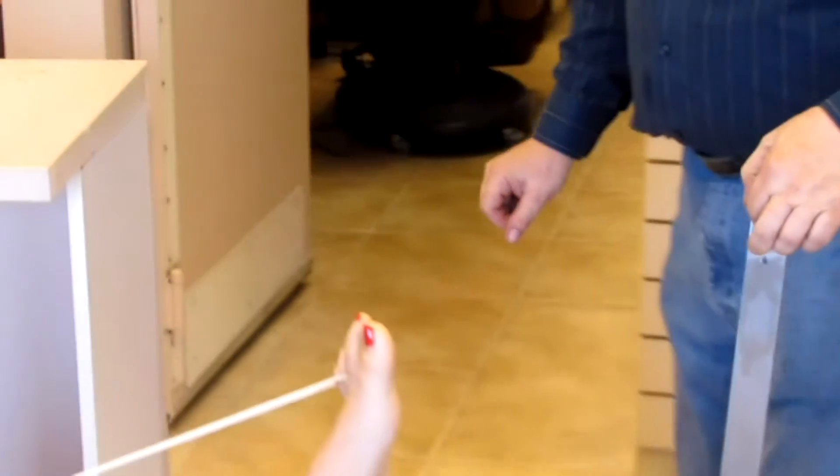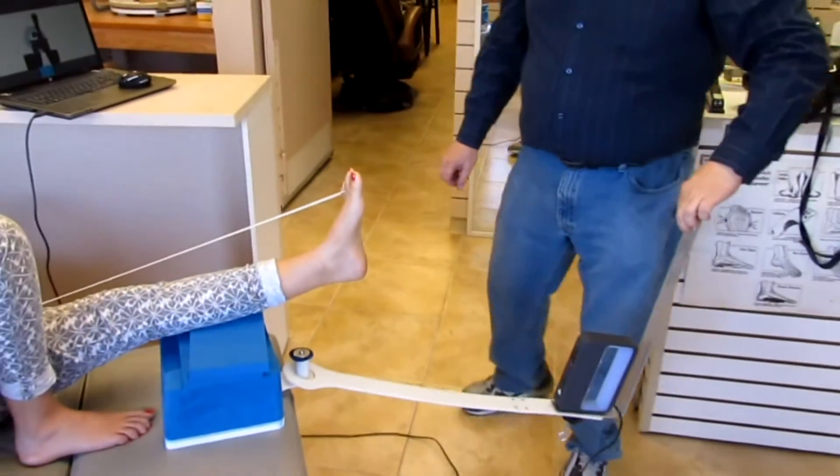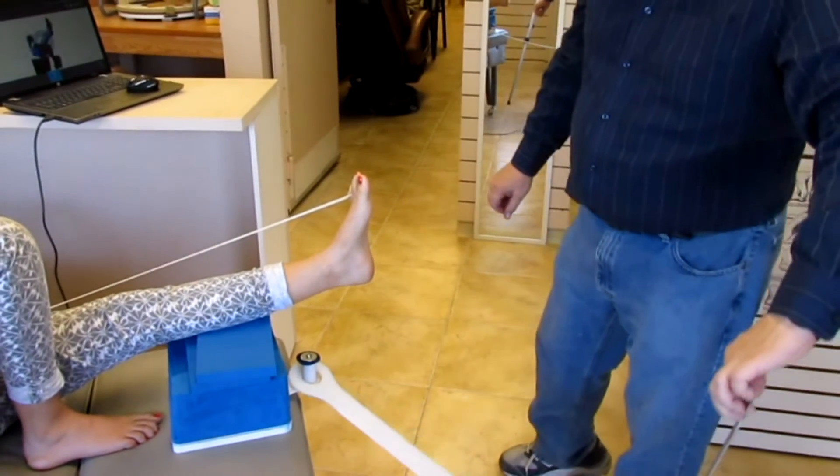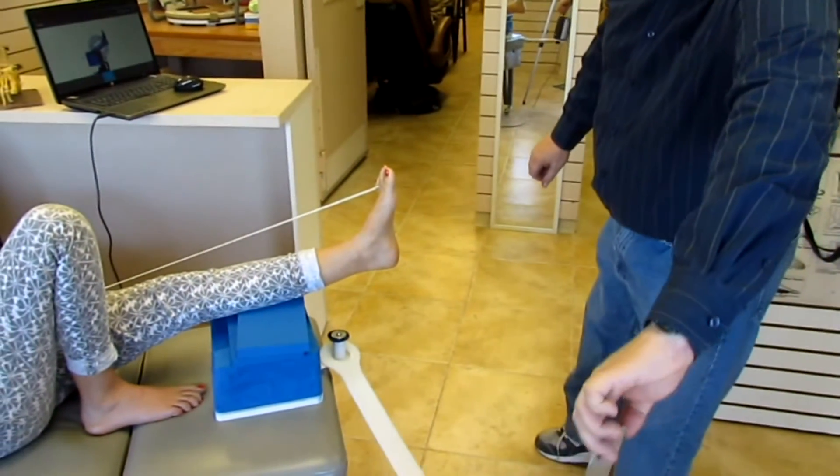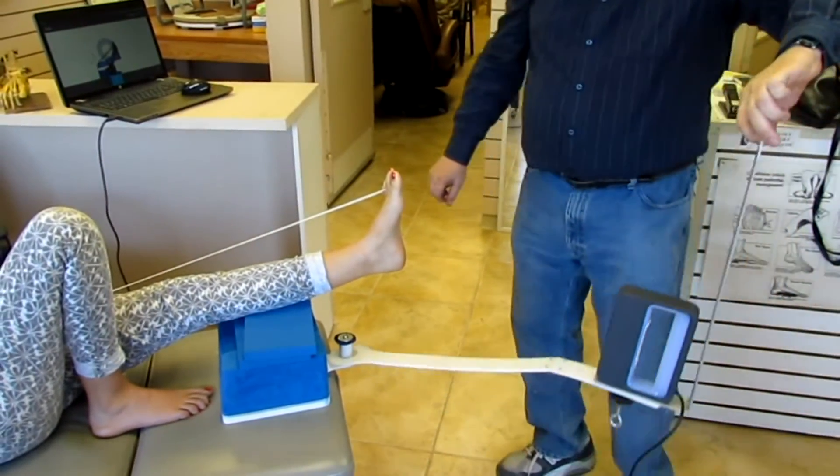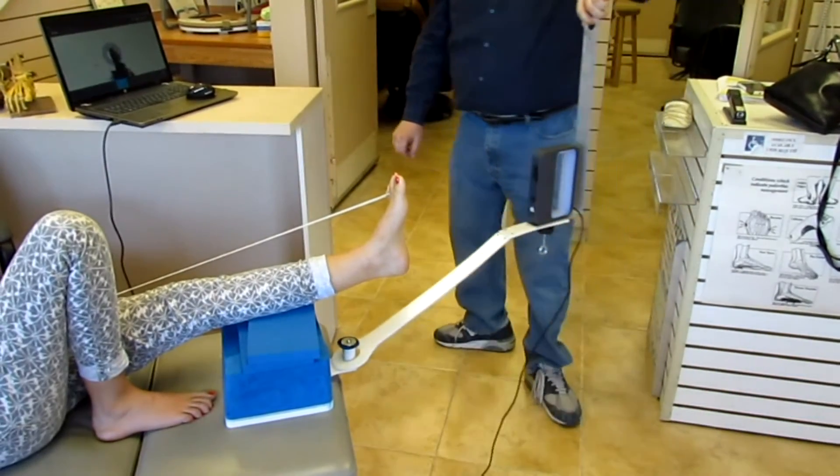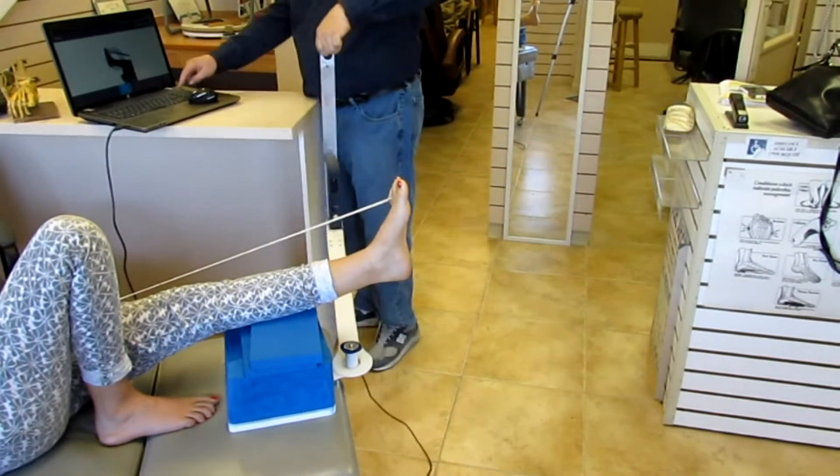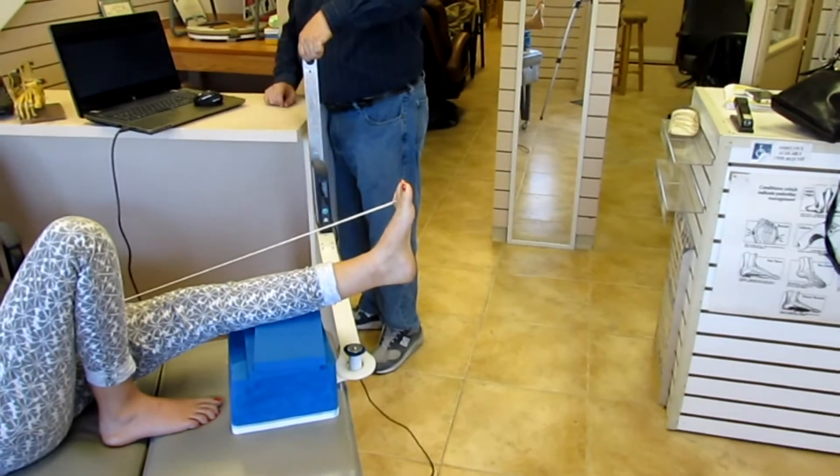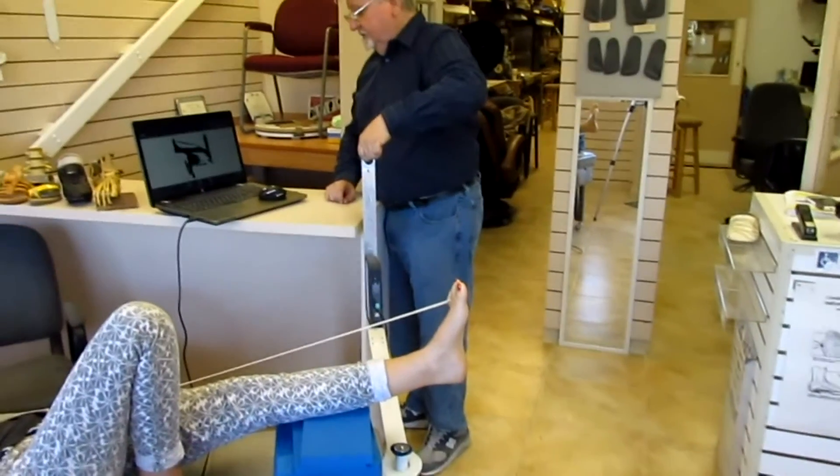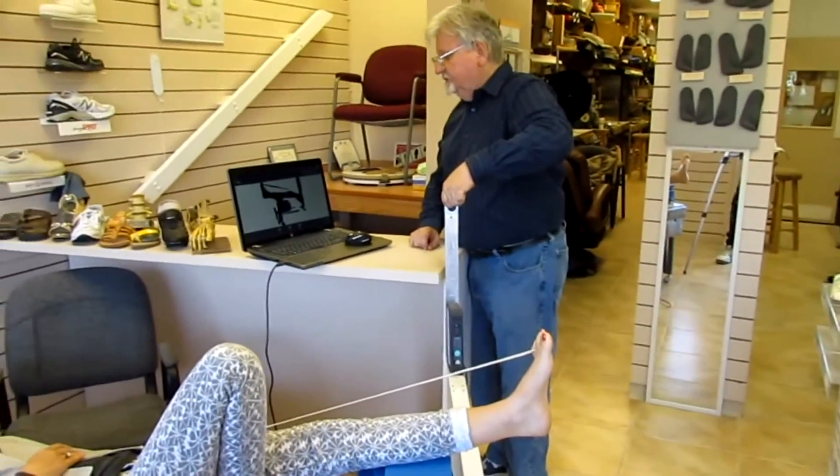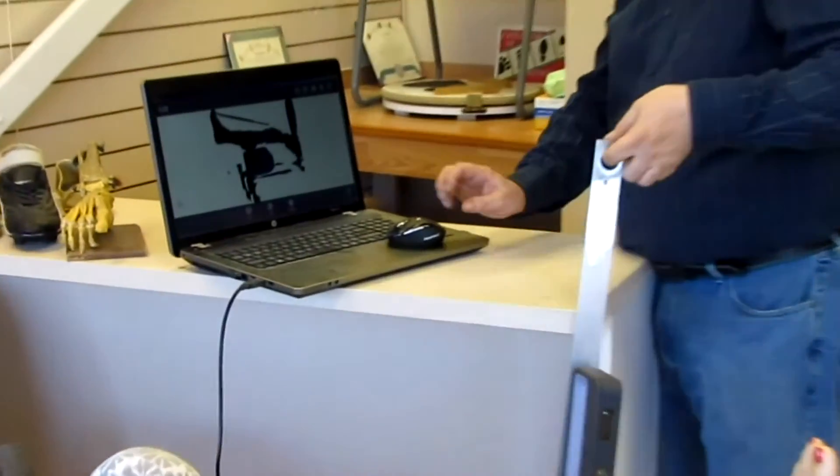We're now ready to scan. And Mr. Arch is taking the scanning device around the patient's foot, up into the middle of the foot, around and around the toes, and then hitting the return key on the computer, which now grabs the picture.